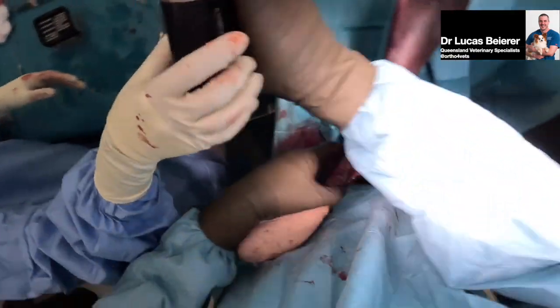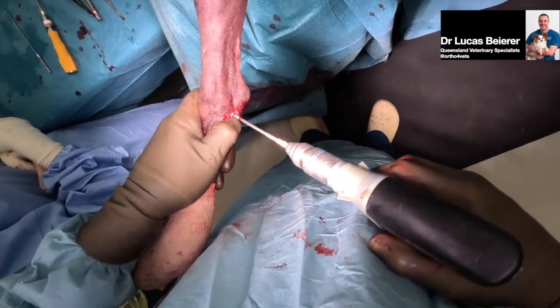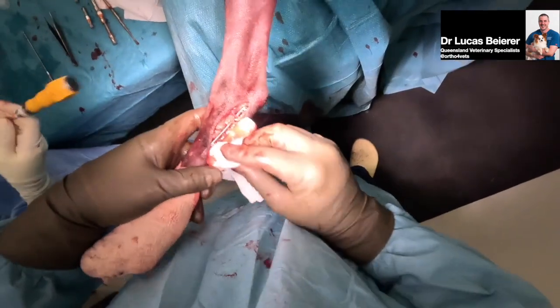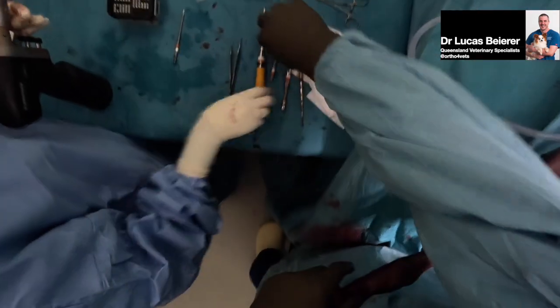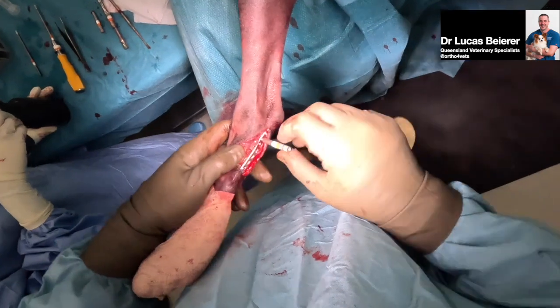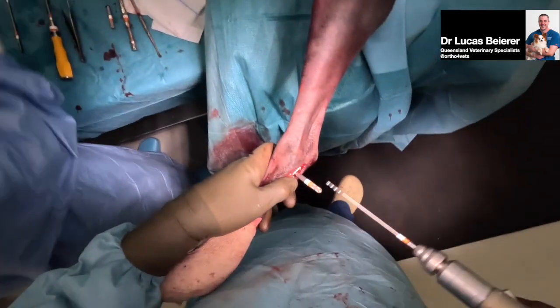So ultimately we want to have three above and three below the problem. Tighten that by hand. And the 2-4 plate, I think, is plenty of metal for this dog. It's lower profile. You could potentially use 2.7 screws and the 2.4 plate. That gives a lower profile plate with the slightly larger core diameter of the 2.7 implant. We haven't chosen to do that today, but that's a very good option.